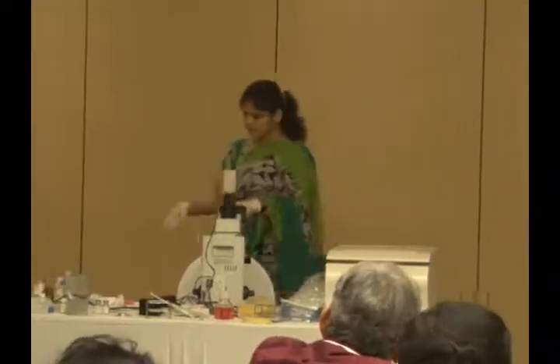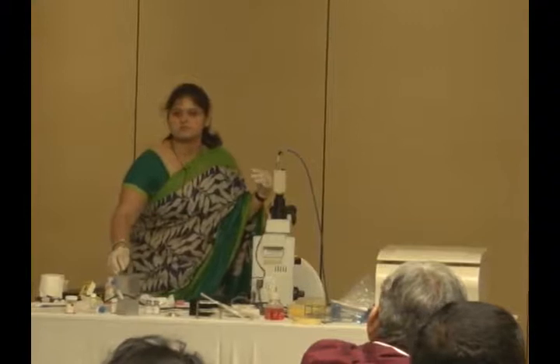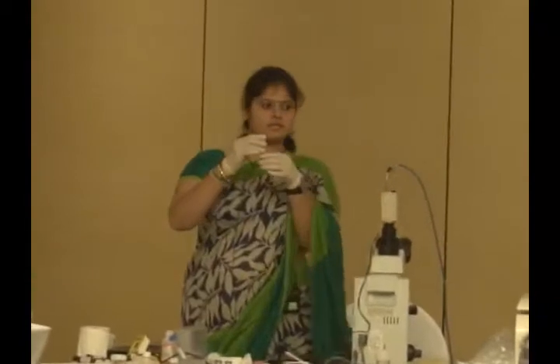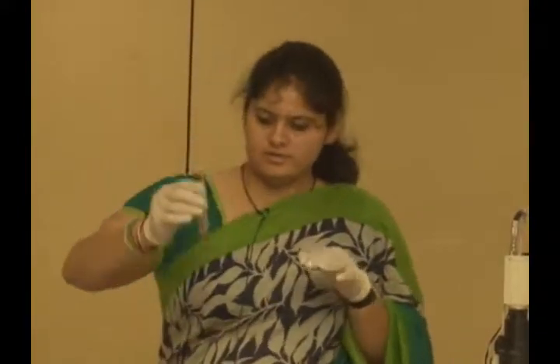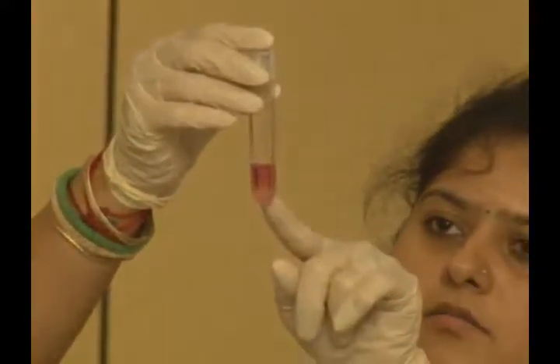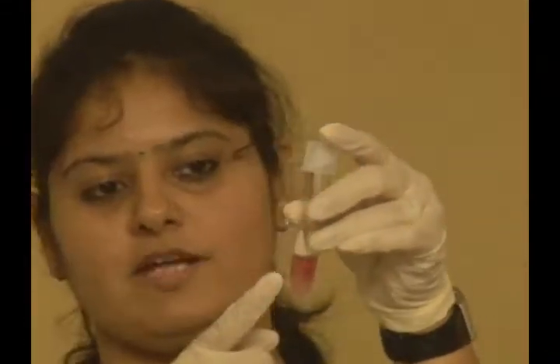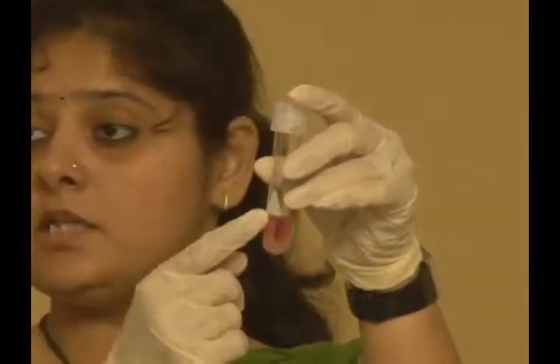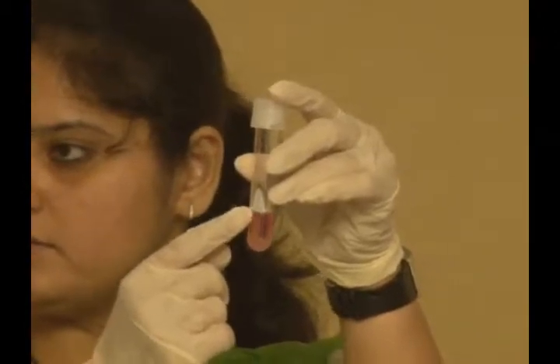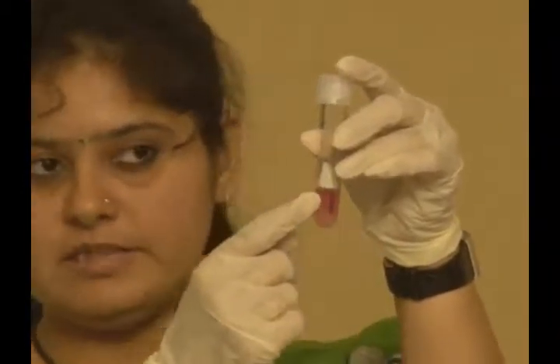Now let us move to the swim up technique. Unlike density gradient, in swim up we take the sperms which are moving upward, not the pellet, right? See, can you see this hazy part just above the semen sample? That is the motile sperms. These are not very good motile sperm, but you have to take the portion from the top, at least half ml of the medium from the top.